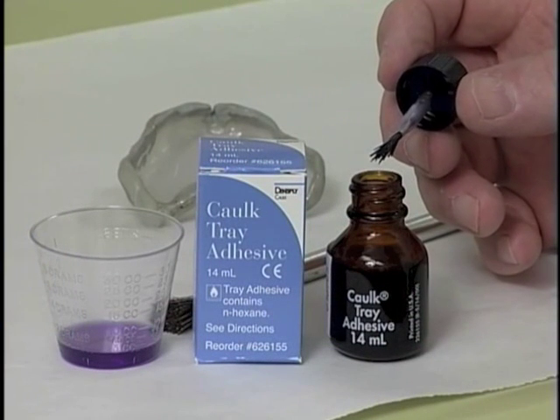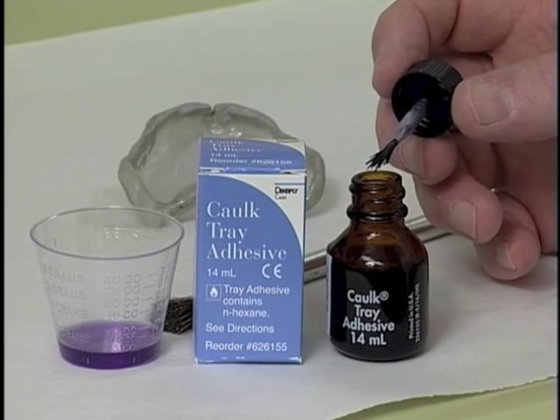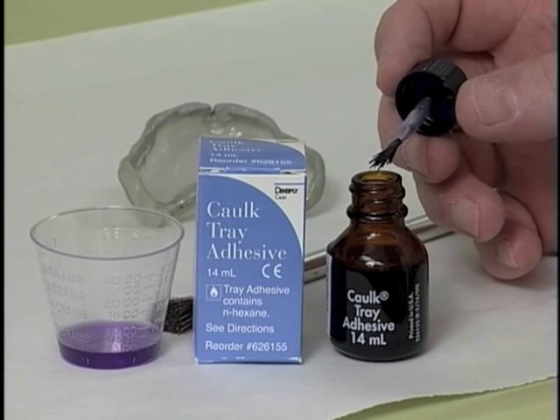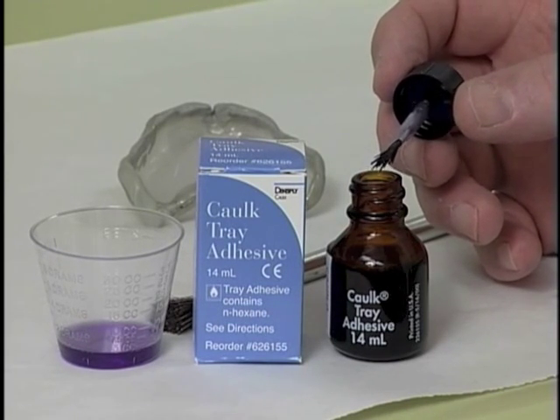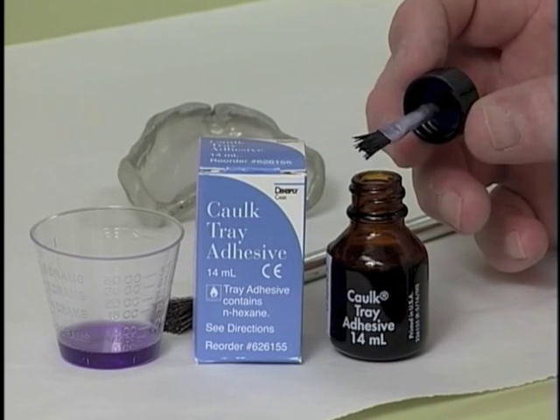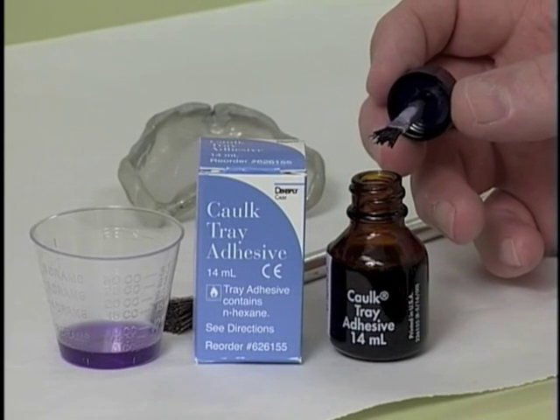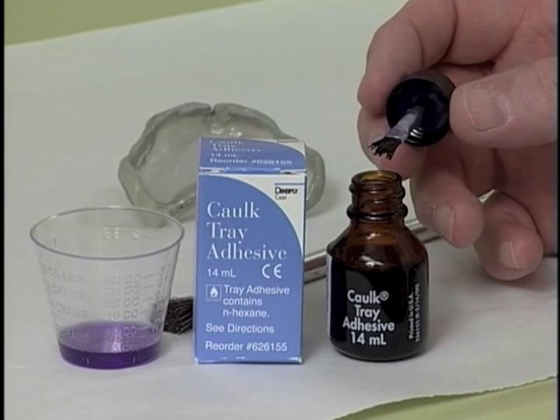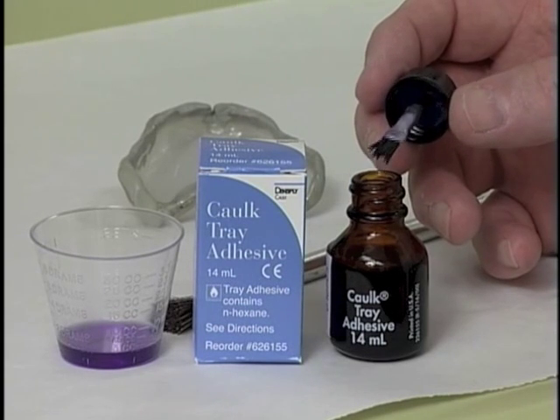The polyvinyl siloxane material that we use for our final impression requires an adhesive. The adhesive that we use for this is Caulk's Tray Adhesive, manufactured by the Caulk division of Dentsply Company. We do not like to use the brush that comes with the adhesive in the bottle, and the reason for that is that the tray that we're going to be painting with the adhesive has been in the patient's mouth, and that would cause a contamination problem.